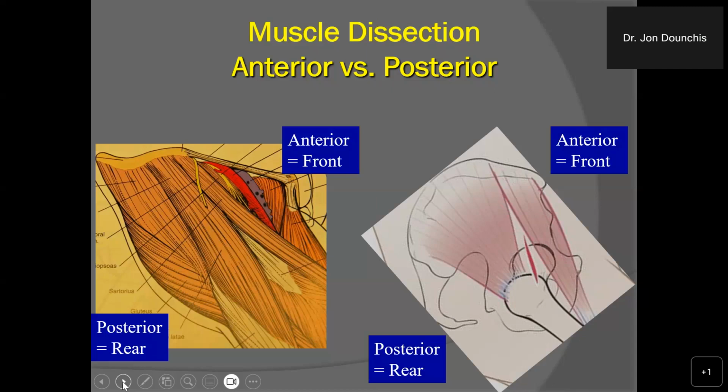It's been used particularly in hip arthroplasty in North America, and that involves an approach from the front side of the hip, which does not remove any of the muscles around the hip joint. We just simply go in between two muscles as depicted up in the right slide there. And this markedly facilitates rehabilitation. There are no restrictions after the procedure, and the muscle function is maximized after surgery. Next slide.